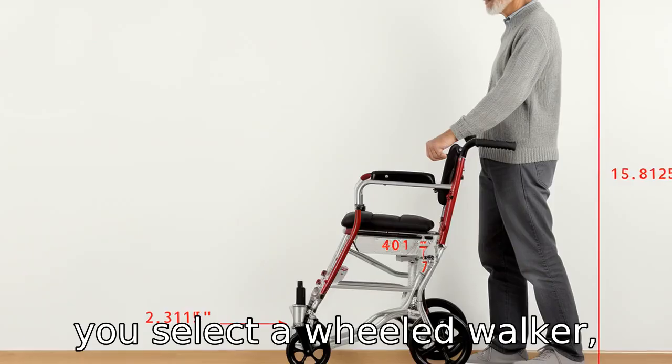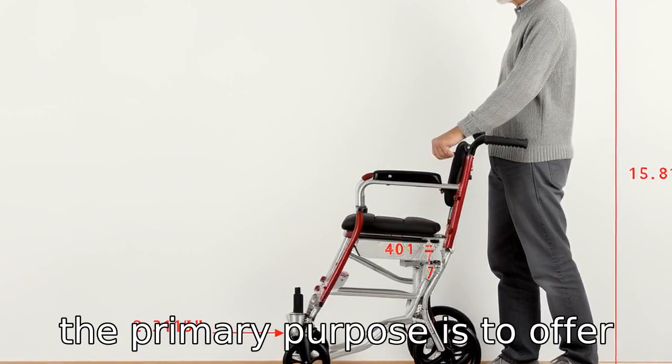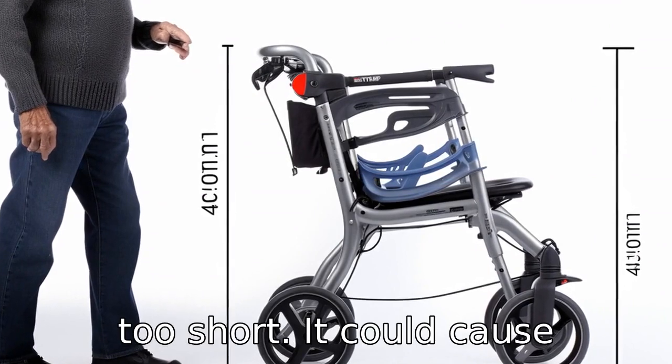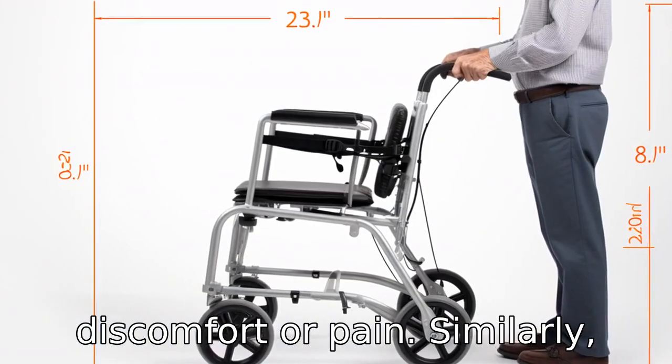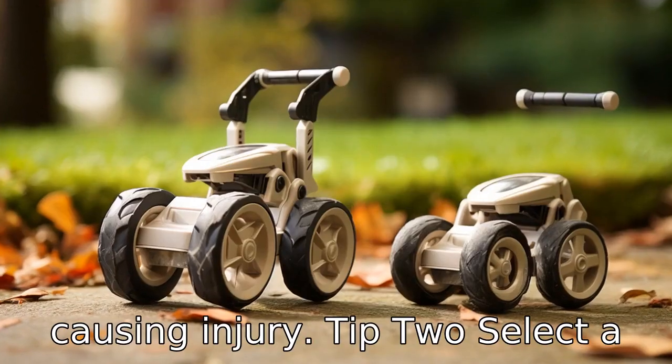Whenever you select a four-wheeled walker, make sure it suits the user's height and weight. After all, the primary purpose is to offer stability. If it's too tall or too short, it could cause discomfort or pain. Similarly, if it can't support the user's weight, it may easily break, causing injury.